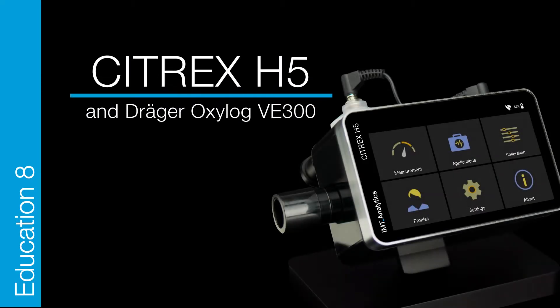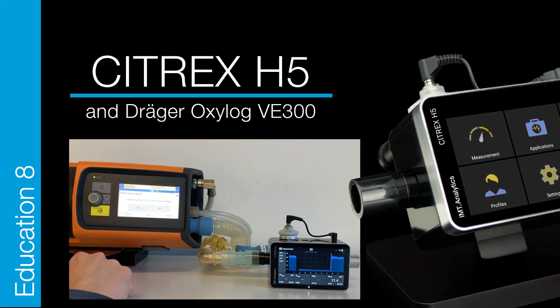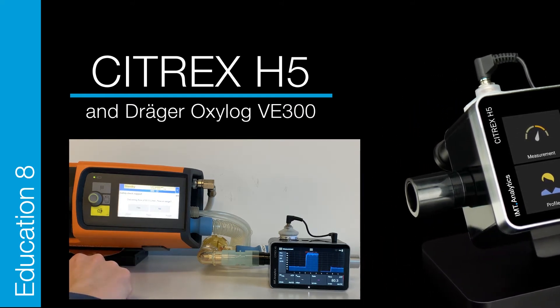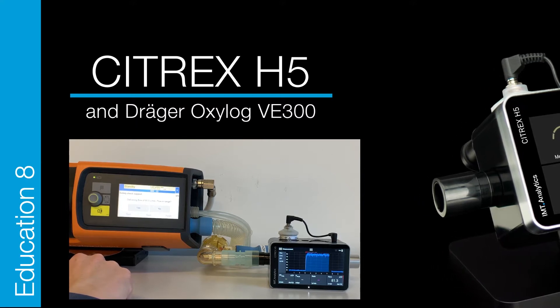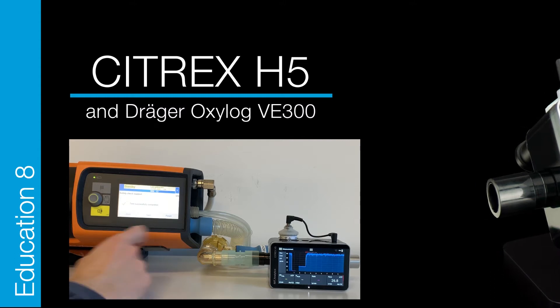Citrex H5 EducationAid: Citrex and Draeger OxyLog VE300. The Citrex H5 is designed to support you in a variety of daily applications, thanks to its precision and reliability. You can use the Citrex to test the OxyLog VE300.